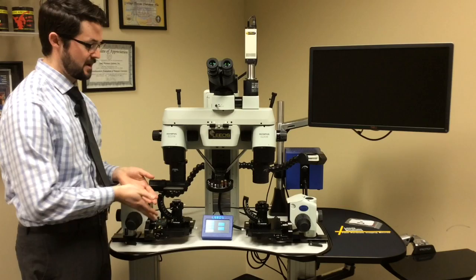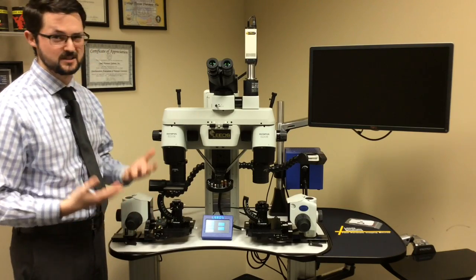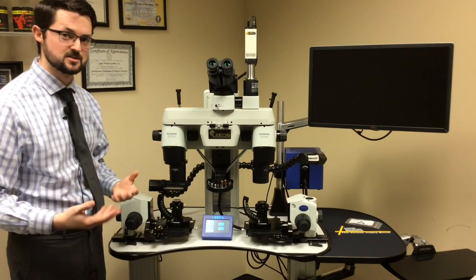The way I like to do it is to have the microscope, or specifically the quad lamps, turned off for at least 10 to 15 minutes just to cool the bulbs down.